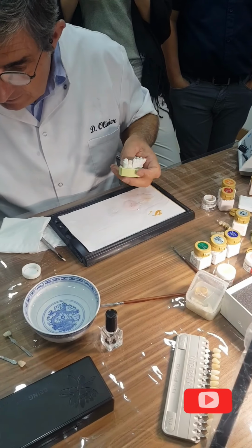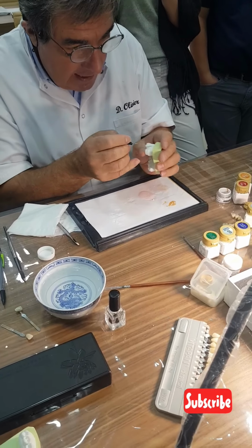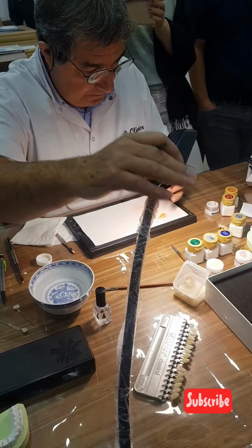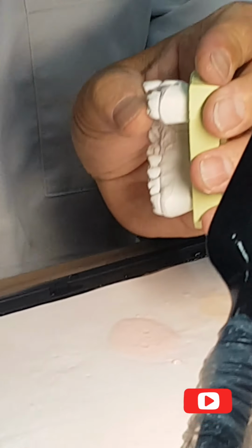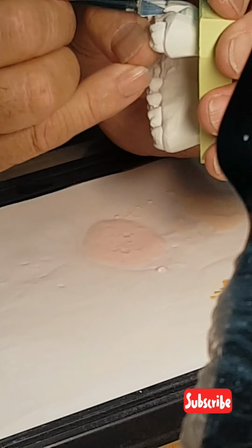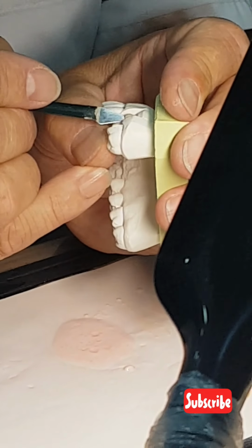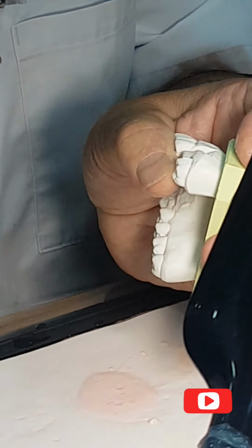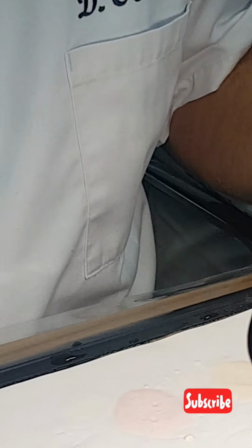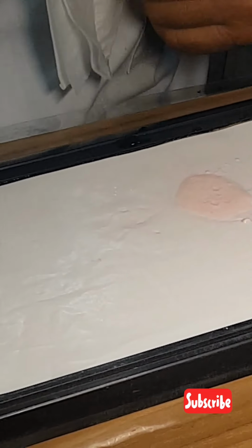That's my root shade, and I continue. I draw now the limit of my root with my round instrument at a good level. And I can start the build-up, the pure build-up of my crown.